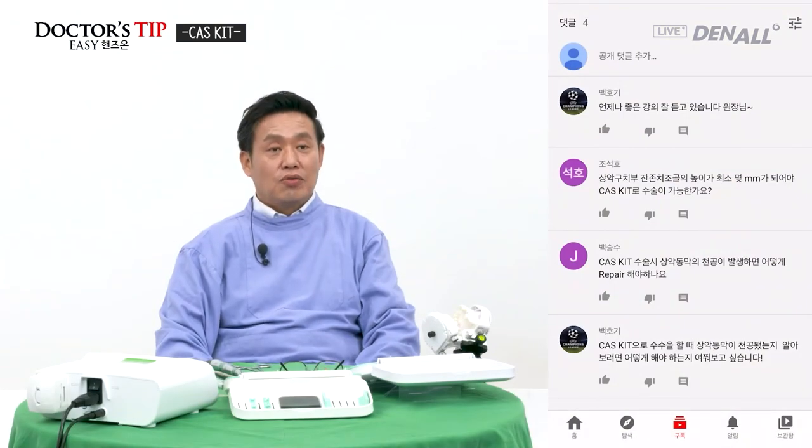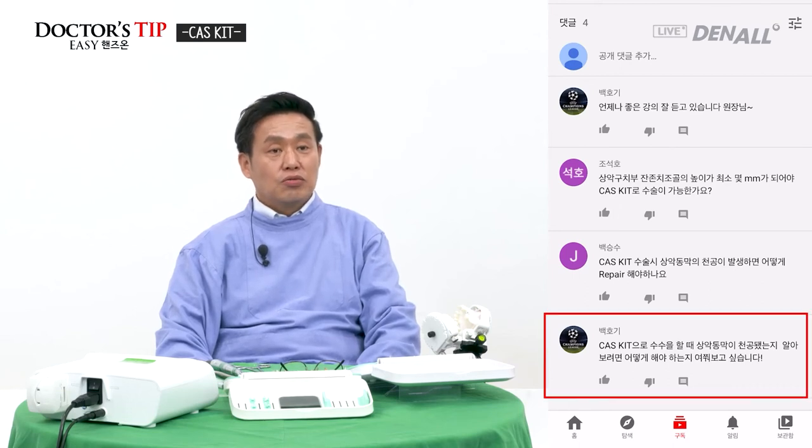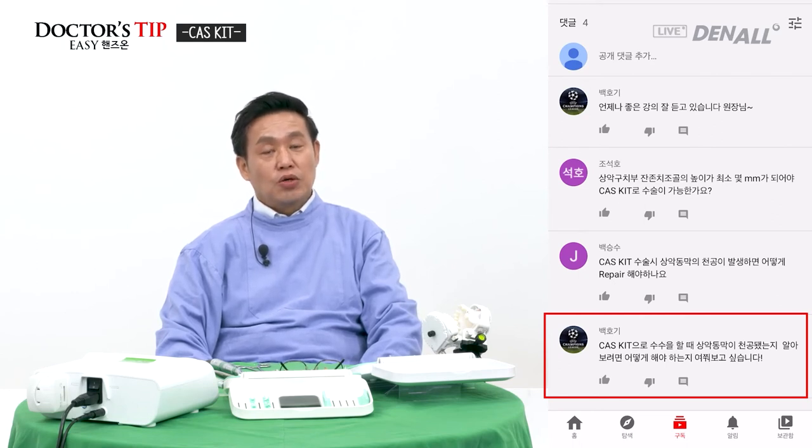Q&A session. Let's look at some of the questions we received. Dr. Park asked, when we do the surgery with the CAS KIT, how can we check the sinus membrane perforation? As I explained before, when we do the CAS KIT surgery, hydraulic lift is done.